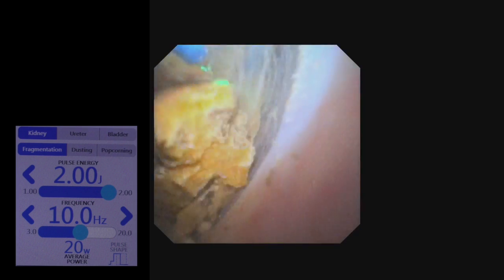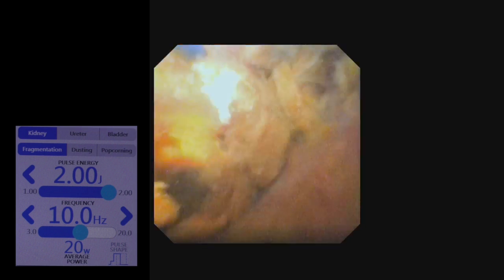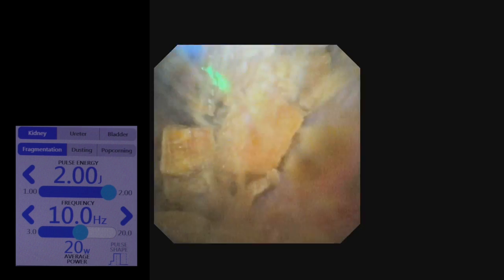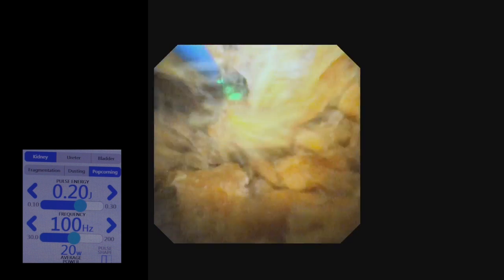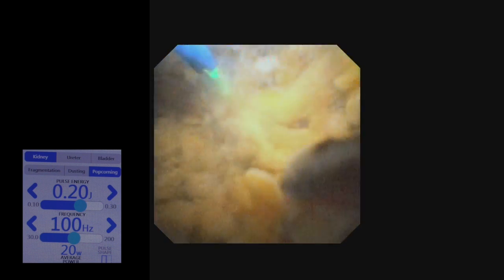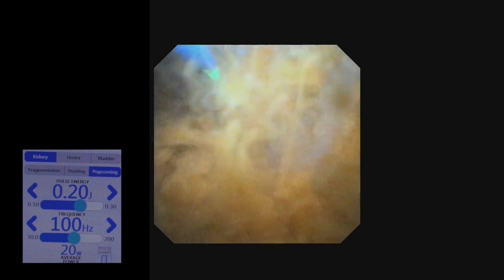So we switched to fragmentation mode at 10 Hz and 2 Joules. The stone was converted into fragments. The core of the stone was hard, and therefore it was a good decision to fragment it. After fragmentation, popcorning was done using 100 Hz and 0.2 Joules, and all the fragments were converted into fine powder in a short span of time.